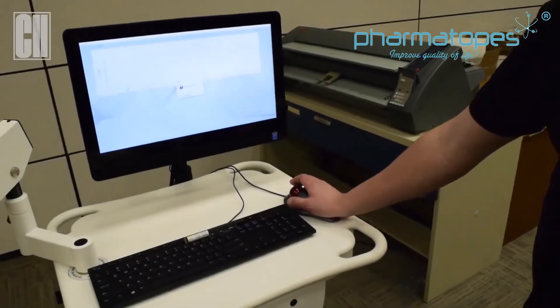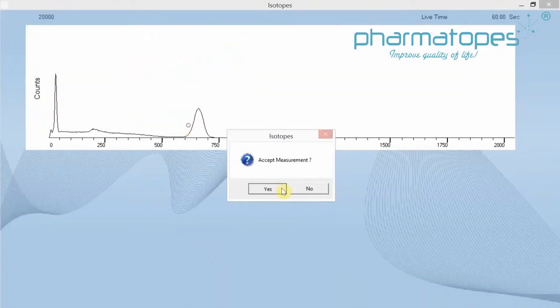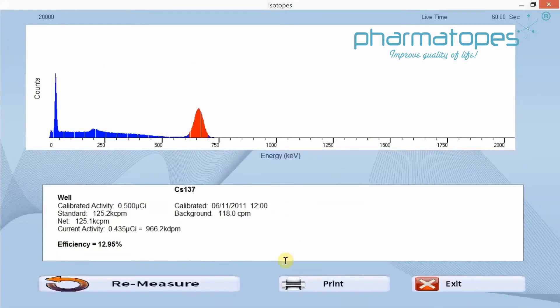Once the cesium count is completed, click yes to accept the measurement, and you'll see a result for your efficiency. For the well detector, you should see an efficiency of 8.3 to 16.6 as an expected value. Once you're within limits, that would be your current efficiency for cesium on the well detector. Once that is done, you can then exit.